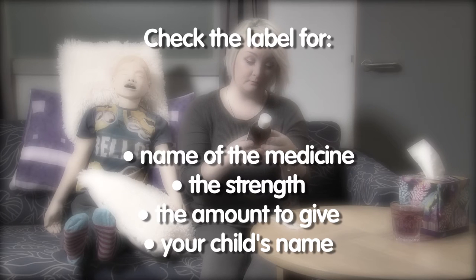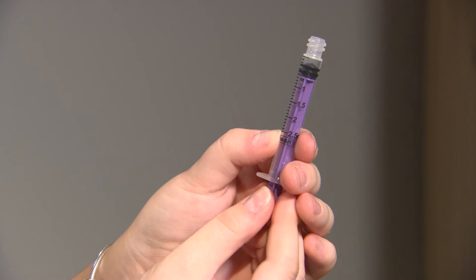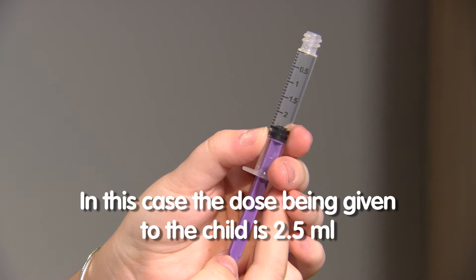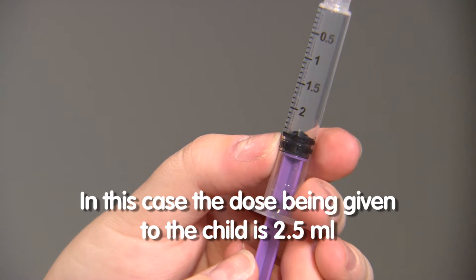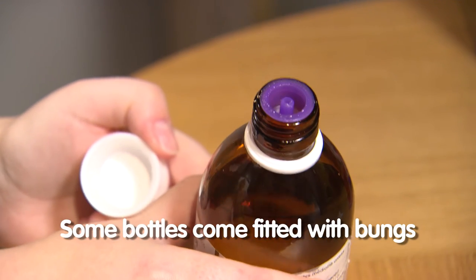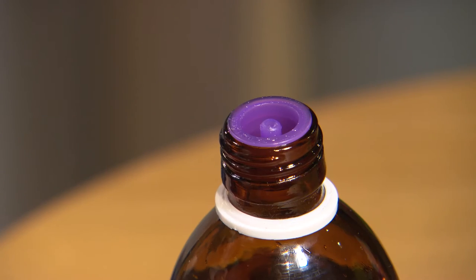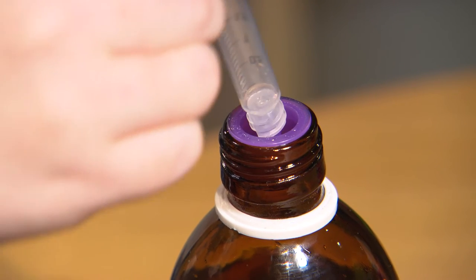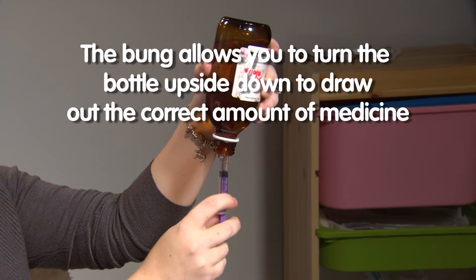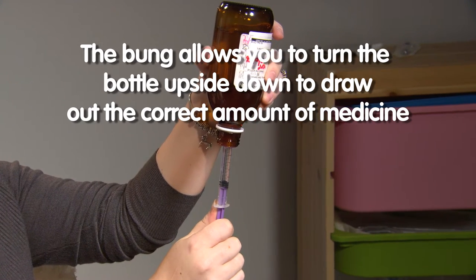For older children you can explain what you are going to do to help reassure them. Getting the right dose into the syringe can be a tricky business. In this case the dose being given to the child is 2.5ml. Some medicine bottles come fitted with bungs which fit securely into the top of the bottle. There is a small hole in the bung into which you put the tip of the syringe. Using the bung allows you to turn the medicine bottle upside down to draw out the correct amount of medicine without spilling any.